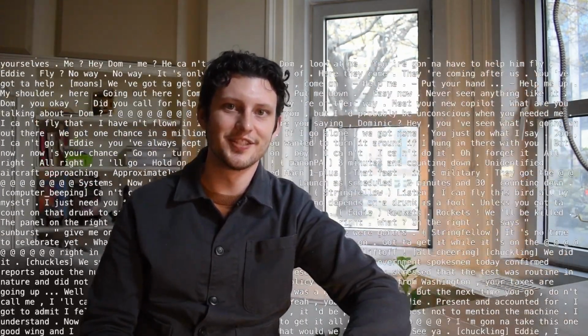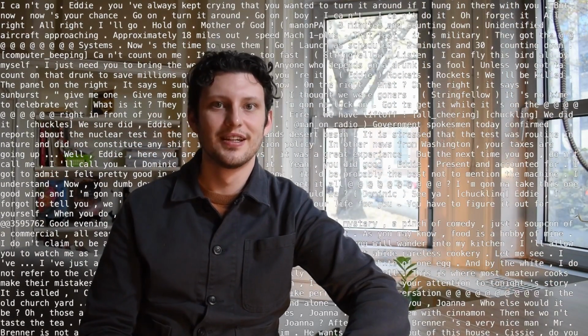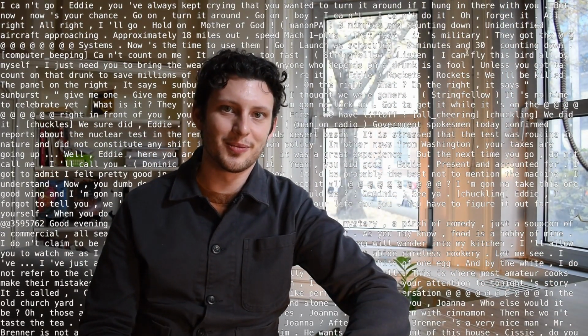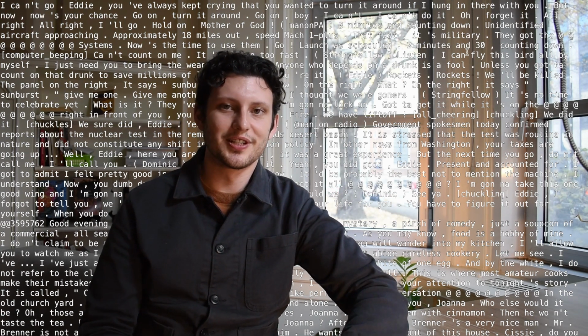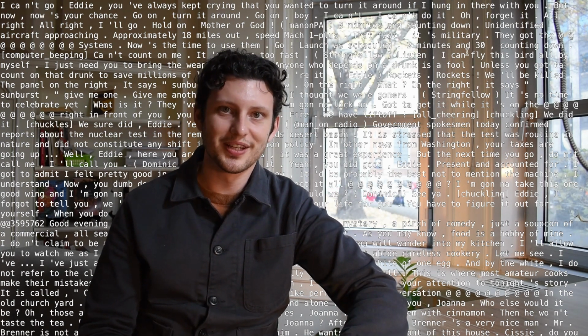We trained our model on the TV corpus dataset. This dataset contains British and American shows from the 1950s to 2018. This dataset allows our model to have a sense of natural spoken language, which is most likely what the user will want to communicate when spelling.